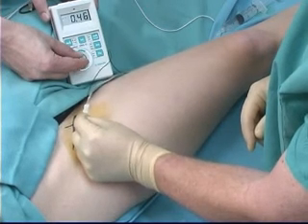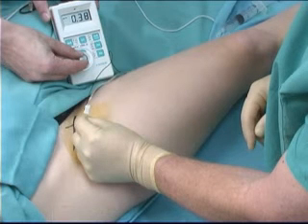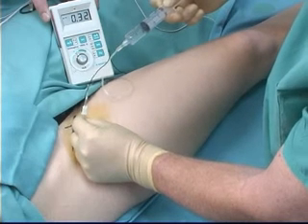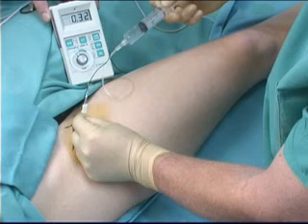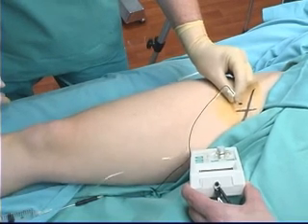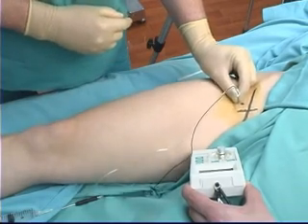The nerve stimulator is now turned down to 0.3 to 0.5 milliamps, and brisk contractions of the quadriceps muscle must still be present. Injection of local anesthetic agent or any other conducting fluid, such as normal saline, as in this case, will cause the muscle twitches to stop immediately. This is a positive Raj test, which gives further assurance that the block will be successful. This recording, from another angle, shows the sartorius muscle twitches followed by the quadriceps muscle twitches due to femoral nerve stimulation.